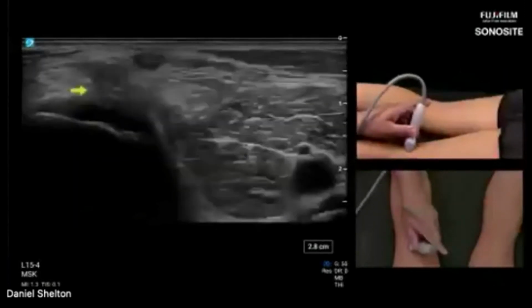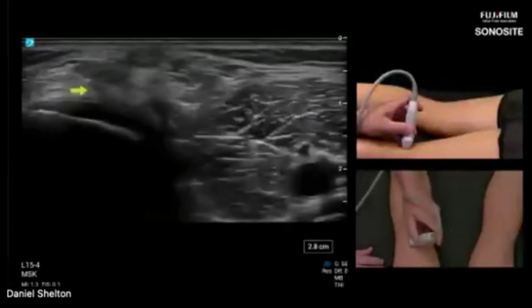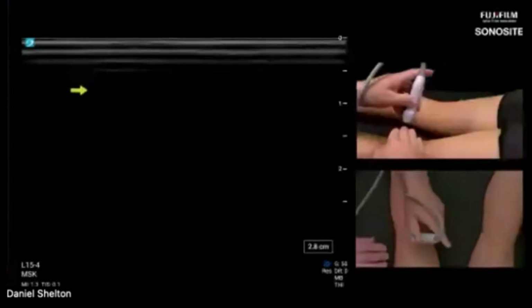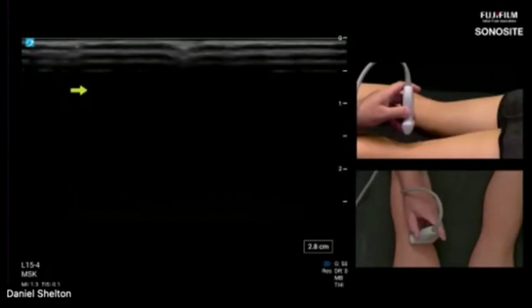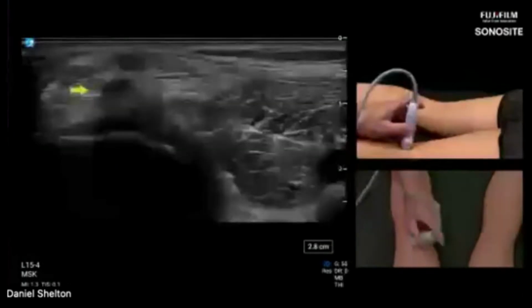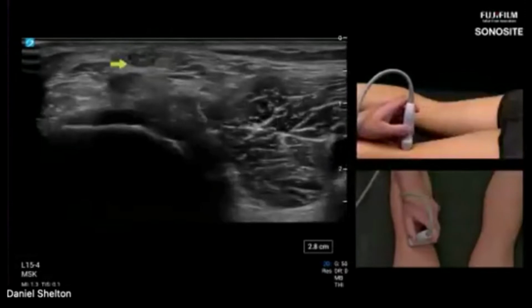And really what it was, and depending on the patient's body habitus too, you're really not able to palpate with the transducer as much as I am today. That ability to let the probe angle get away from you relative to the tendon really increases as the patient's size increases. So as your probe is further away from the hamstring, where I can physically sonopalpate the fact that I'm sitting here teeter-tottering the transducer right on the semitendinosus right here. See this oval right up top?